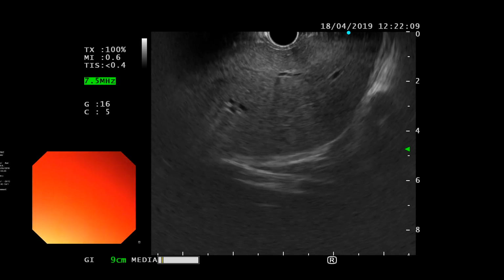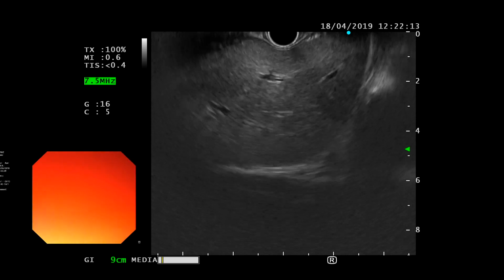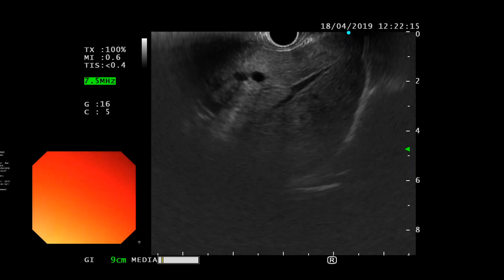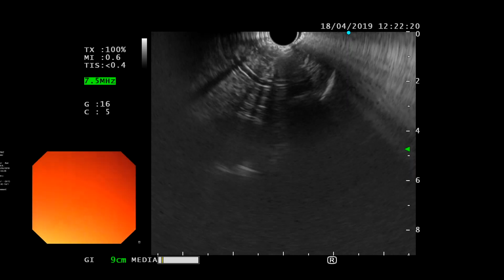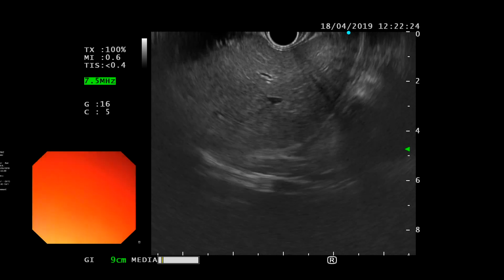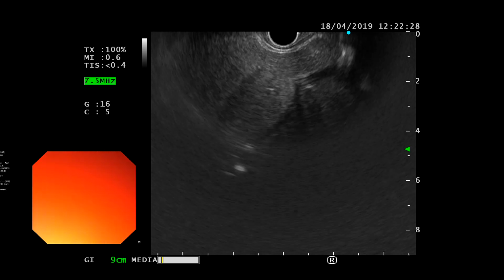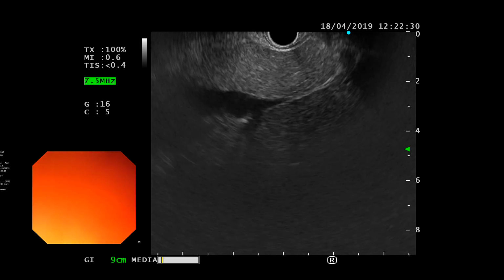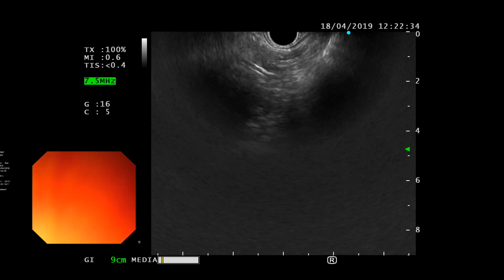The other thing is with liver metastases, they don't have to be hypoechoic. You can get liver metastases that are bright in appearance and hyperechoic. So you go to one extreme, and you keep going clockwise till you lose the liver completely, and you still keep going, because this is actually the right lobe now, the posterior IVC area.